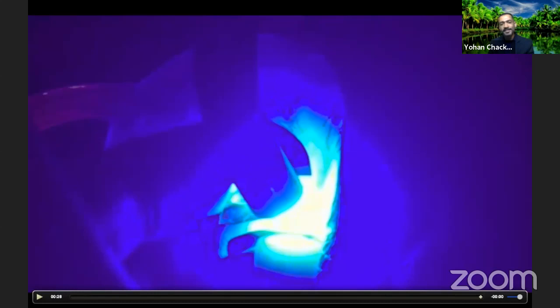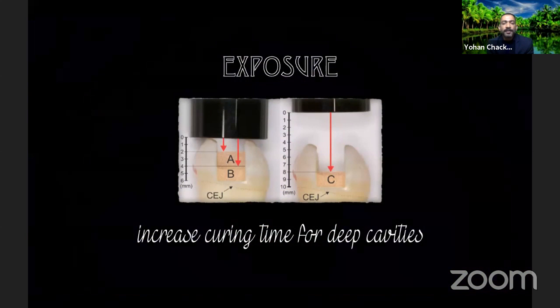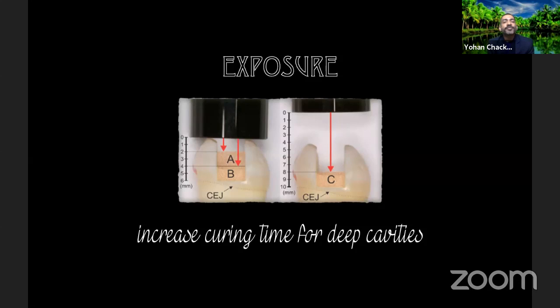This is a very, very simple modification to your technique that you're using for composites, whether it is anteriors or posteriors. Use another finger, the thumb or the index finger, support the curing light, and you will find that your curing technique improves vastly. And I said earlier, if you're curing deeper cavities, then you might have to have a longer exposure, or you'll have to do multiple exposures.